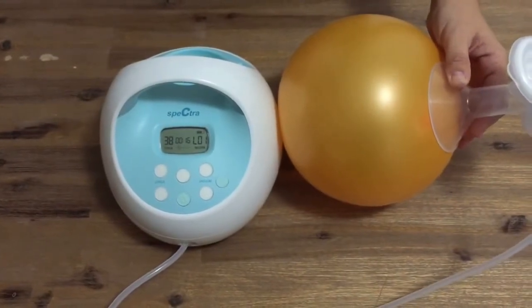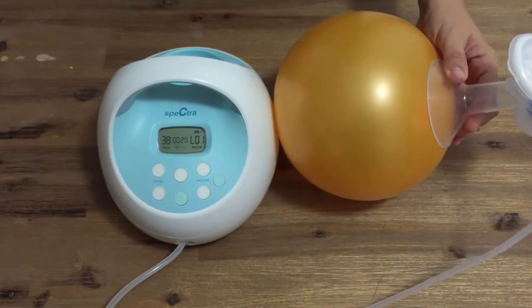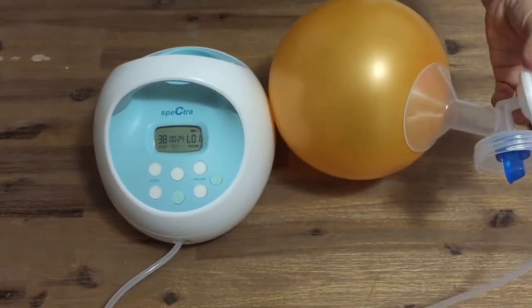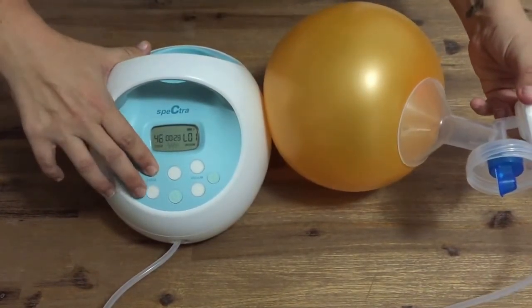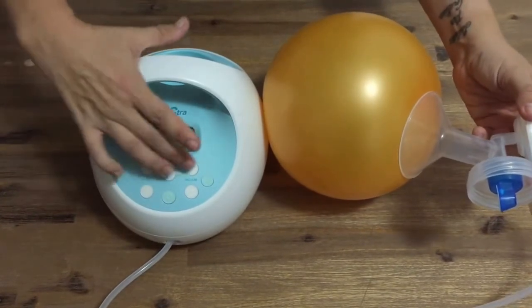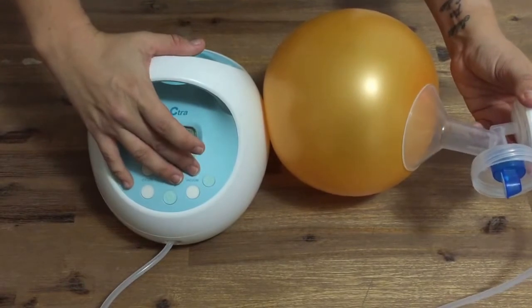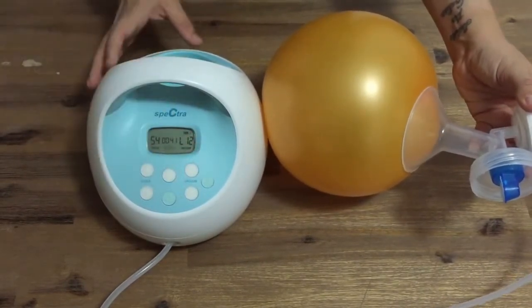The Spectra S1 operates in the same way as the S2, but this is not plugged in at the moment — it's running from battery. Here is the pump at its lowest levels, then at maximum cycle speed at suction level 6, and now at suction level 12.